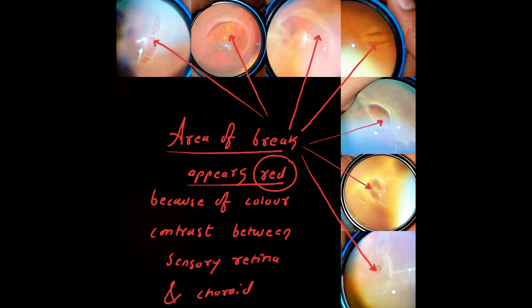As you can notice in all these lesions, the area of the break appears red because of color contrast between the sensory retina and the underlying choroid.